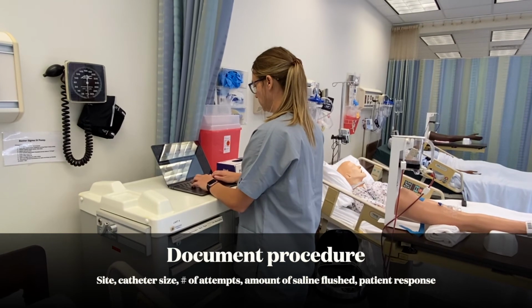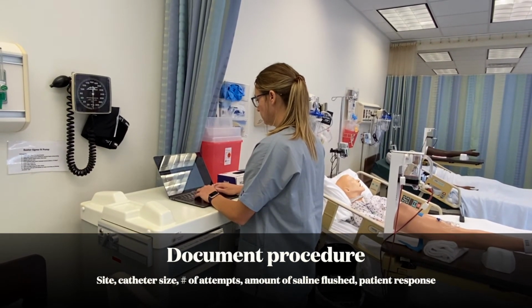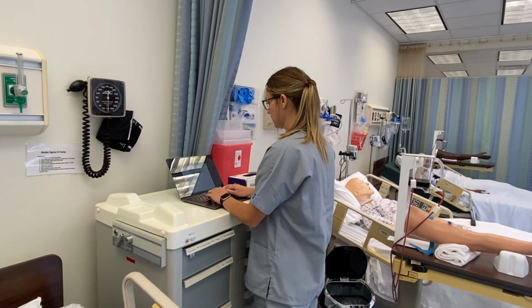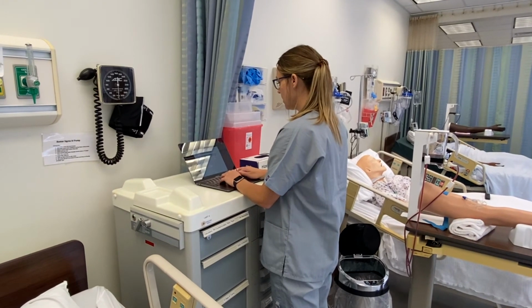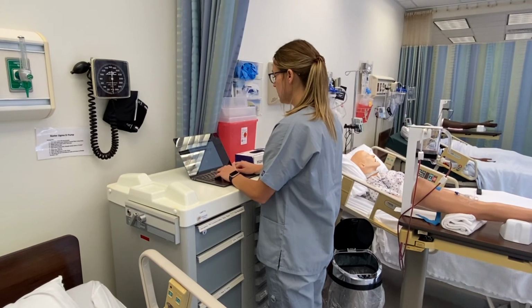Verbalize documentation of the IV insertion procedure, including site, catheter size, number of IV attempts, amount of saline flushed, and patient response. I completed an IV start in the right upper arm with a 22 gauge needle. I had one attempt and flushed 4 mLs of saline, and the patient responded well.